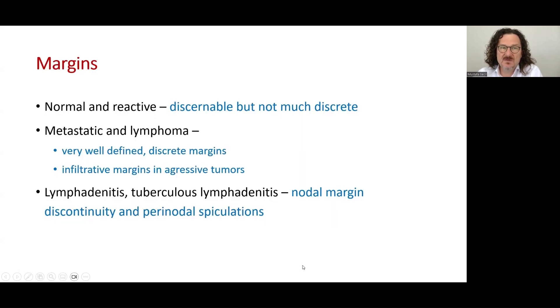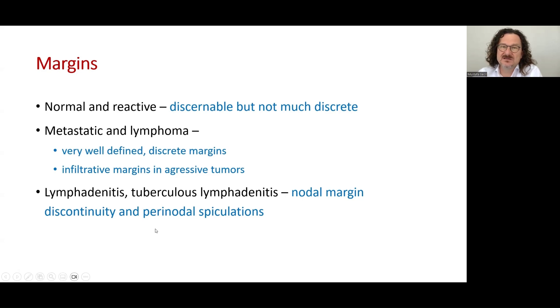The other parameter is the margins. In normal and reactive lymph nodes, the margins are discernible but not too discrete. In contrast, in metastatic or lymphoma involvement, the margins are mostly discrete and well-defined, unless they are aggressive — if aggressive, the margins will be infiltrated. Margin discontinuity and perinodal spiculations are findings of inflammatory lymph nodes.